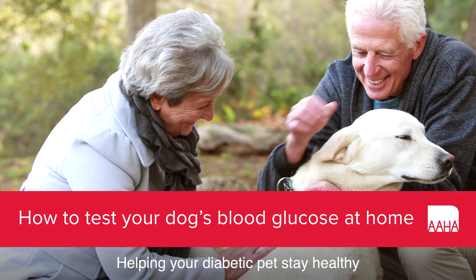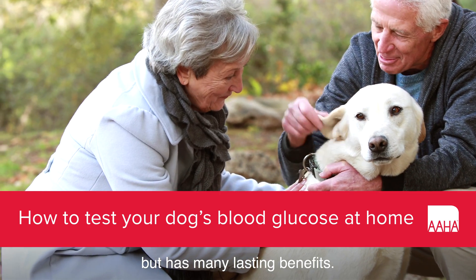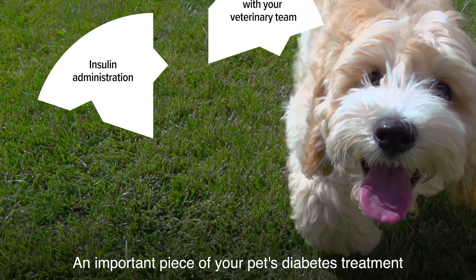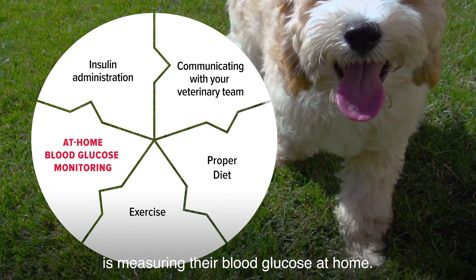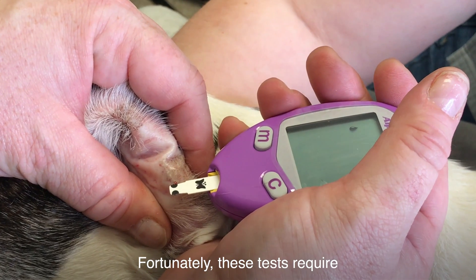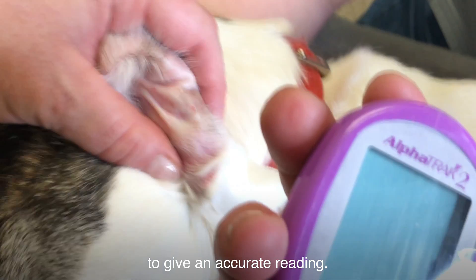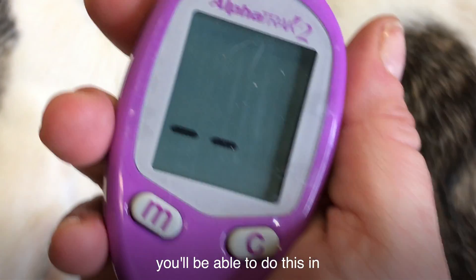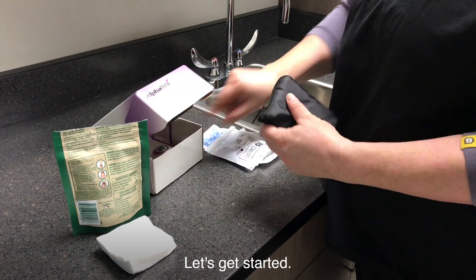Helping your diabetic pet stay healthy takes a few extra minutes each day, but has many lasting benefits. An important piece of your pet's diabetes treatment is measuring their blood glucose at home. Fortunately, these tests require only a tiny drop of blood to give an accurate reading. With a little bit of practice, you'll be able to do this in the comfort of your own home. Let's get started.